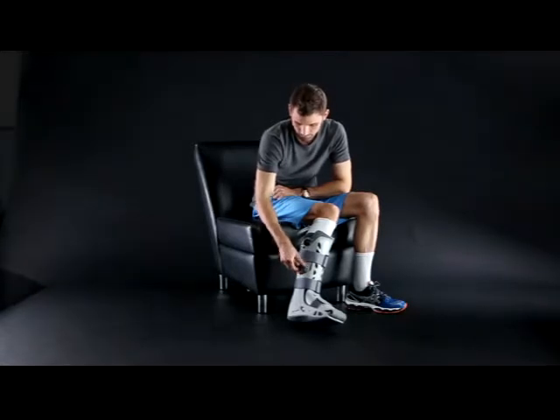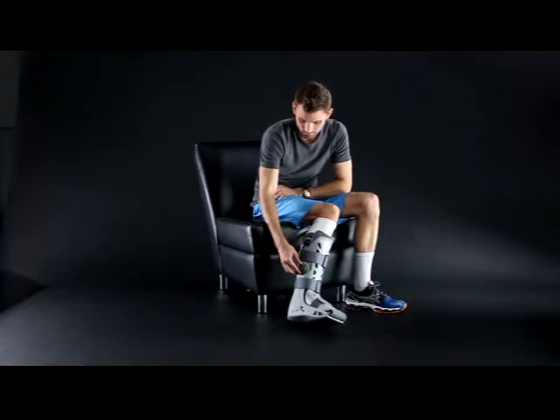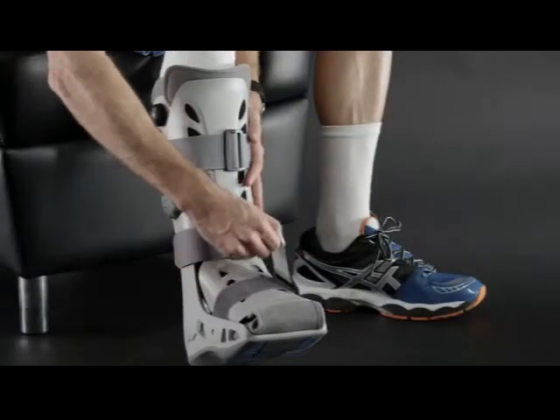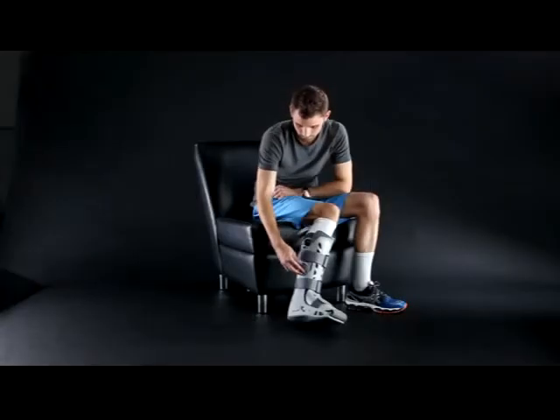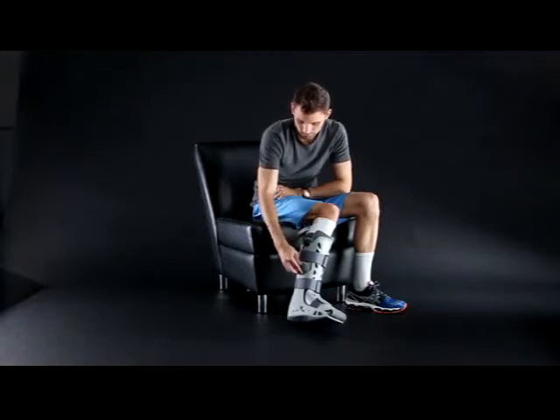Keep in mind that higher pressure provides more support when you're walking, while lower pressure is usually more comfortable when you're sitting or reclining. You can also adjust the boot by tightening or loosening the straps. Always deflate the AirCells before you remove the boot to ensure a proper fit when you reapply the boot.